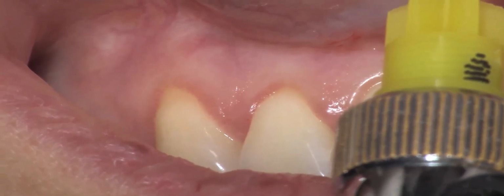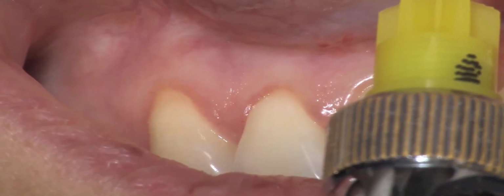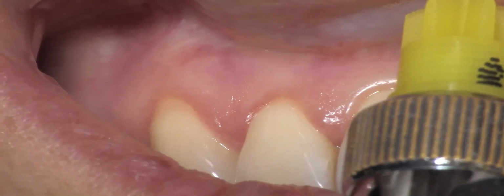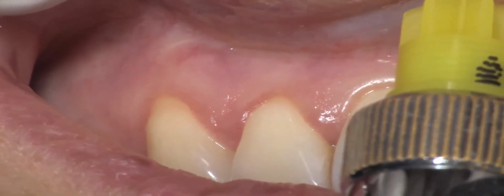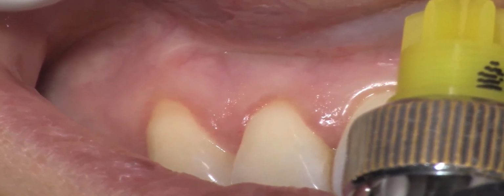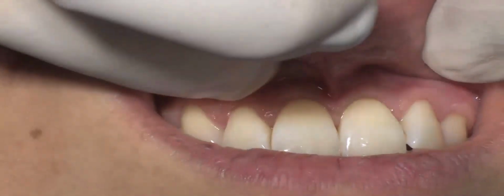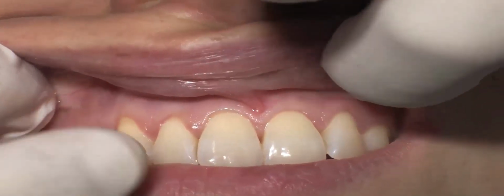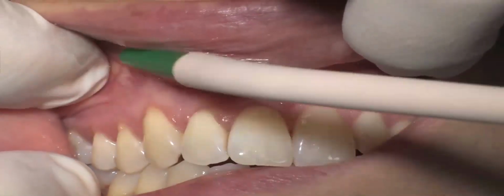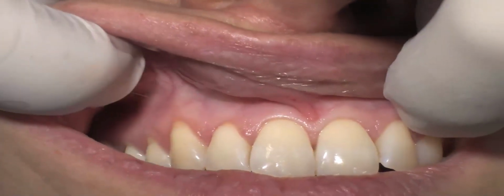And the fact that the lateral will also be included in the flap design permits me to show you the technique for treatment of multiple gingival recessions with no vertical releasing incision. So I can explain it to you. We will make treatment from 2 to 4, while the 5 and 6 are perfectly healthy.